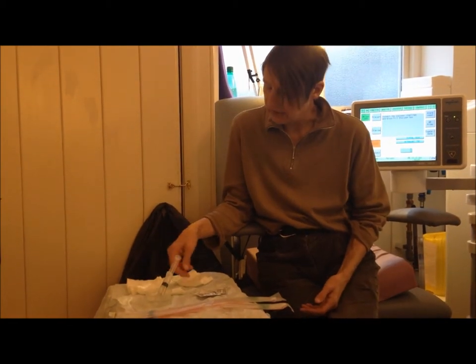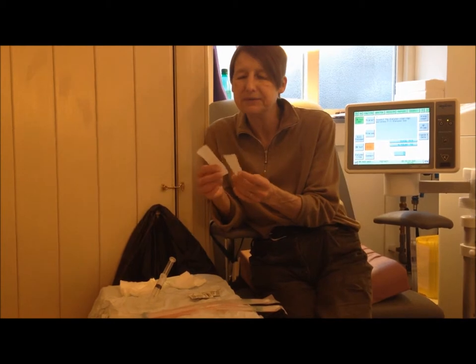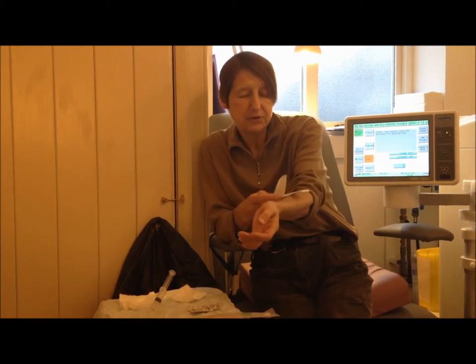Bits of drawers here. And this is the me-fix tape — very important. What this does is it secures the needles to me, so that the needles are secured during the dialysis session.